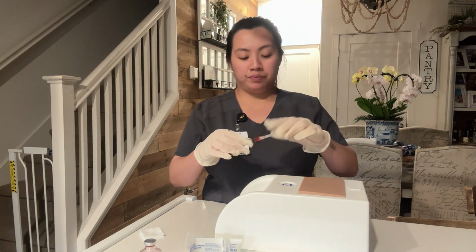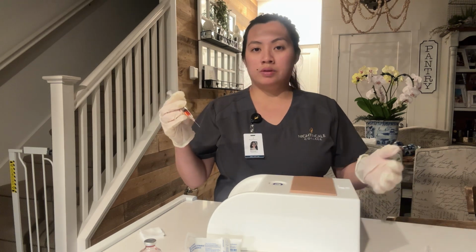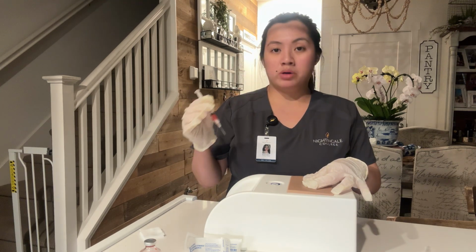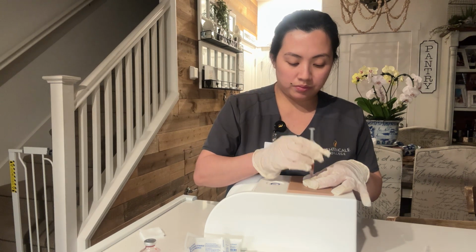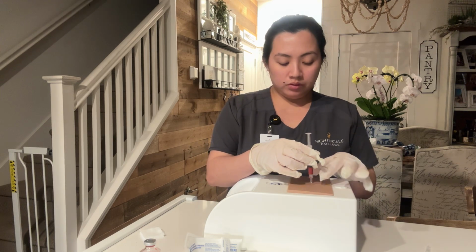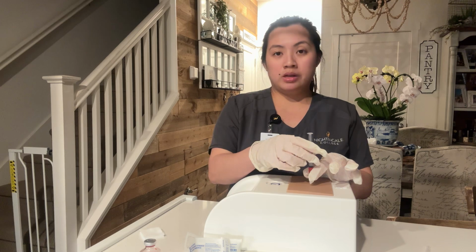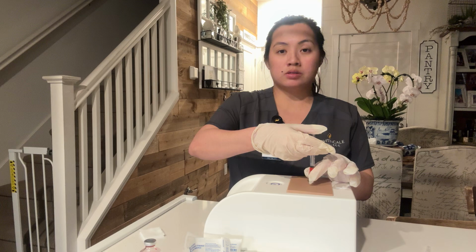Okay, and then we're gonna hold the syringe like a dart between the thumb and the forefinger, and then we're gonna pinch the site using the non-dominant hand and insert the needle quickly at a 45 to 90 degree angle. Okay, and then we're gonna hold down here, and then we're gonna administer. We're gonna stabilize the syringe with the non-dominant hand, and then we're gonna inject the medication slowly over 30 seconds.